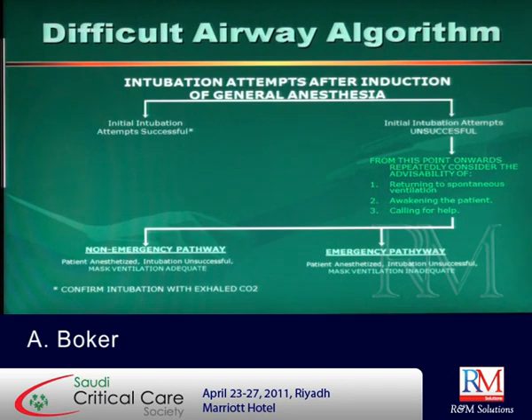Let's go back in slow motion. You try to intubate and you cannot, and now you want to ventilate and you cannot with the face mask. What should you do? I just want your answers for ventilation. LMA, that's number 6. What else? Tracheostomy, that's number 20. I'm saying for ventilation. Bougie, that's number 72. Now I'm talking about ventilation, because the patient will not die because of intubation, the patient will die because of ventilation. Cricothyroidotomy, that's number 20. I want number 2, number 3, number 4.